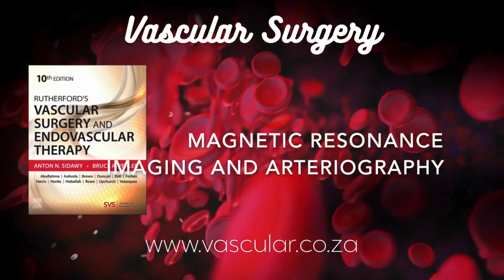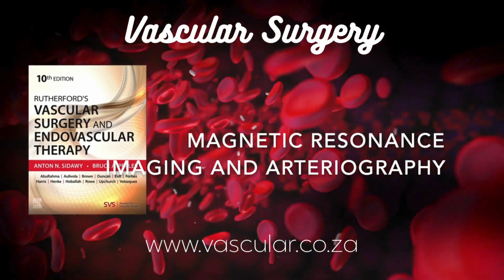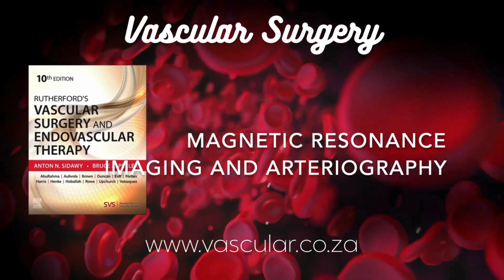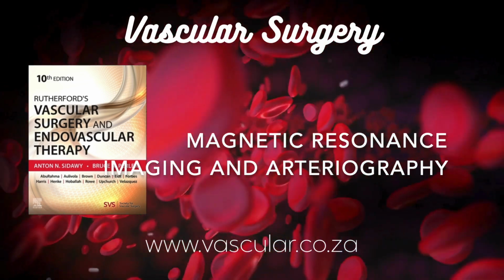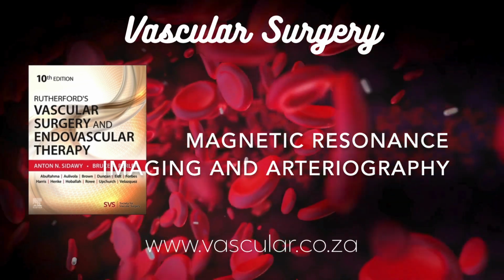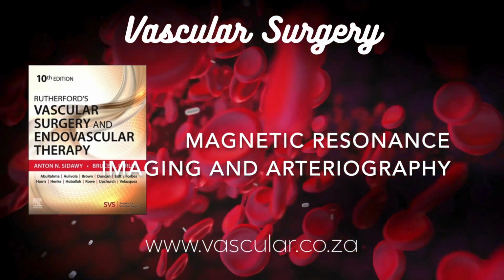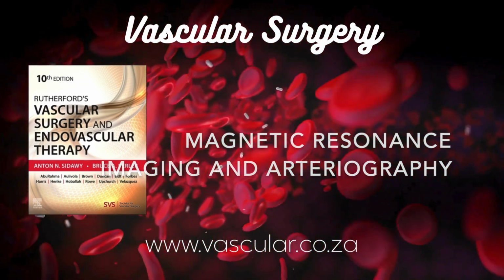The outline also brings up field of view, FOV, and image matrix. How do they affect the final picture? Good points. The FOV, field of view, just defines the physical size of the area you're imaging. Maybe 30 by 40 centimeters across the abdomen, for example, plus the slice thickness. The image matrix determines how many individual picture elements or pixels are packed into that FOV. Think of it like the resolution on your TV screen. More pixels means sharper image. Generally, yes.